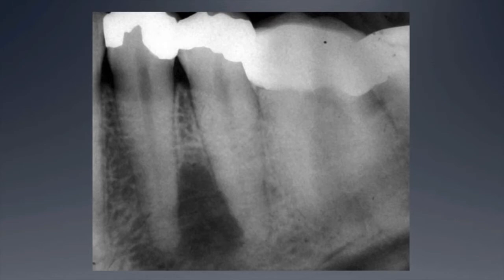And you have to be observant, and that's a good observation. And in a lot of the periapical pathology that you'll see here, the situation with the lamina dura is key. You need to be observant around the lamina dura for signs of infection as opposed to signs of other types of processes. Again, it goes back to pulp vitality testing. Yes, key thing. When you see something like that with a vital pulp, I guess as a general dentist you probably want to refer it out to have a biopsy.